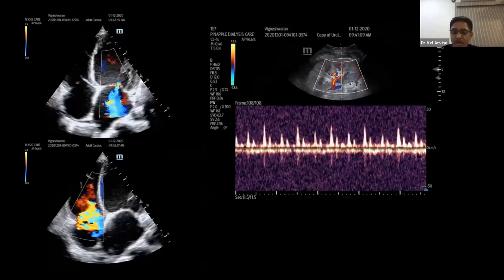So here, you get a double spike. Why is there a double spike? Once you look at the graft Doppler, a spectral flow, you can identify what the heart is doing. This fellow has got a severe LV dilatation. So the heart is making some kind of dancing movement. One spike is bigger, another spike is small. So maybe having some kind of subtle conduction block.